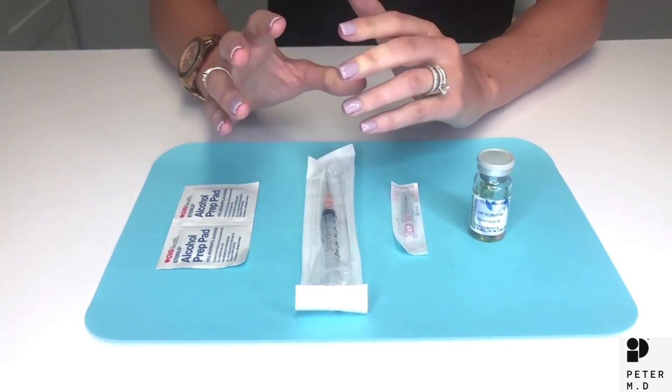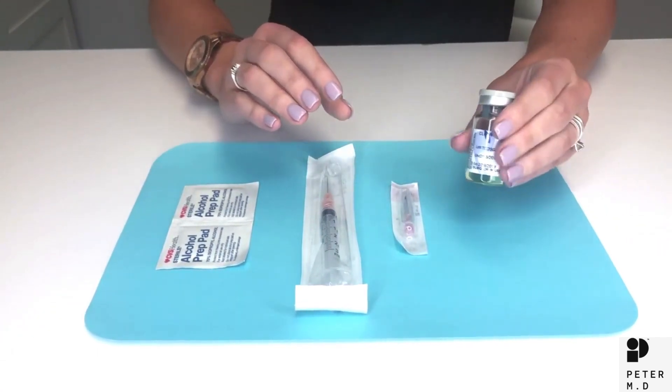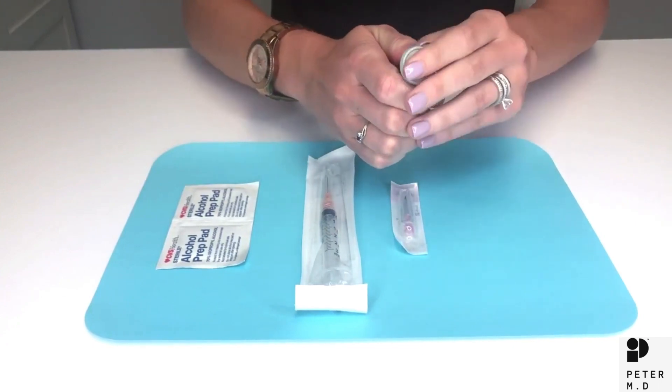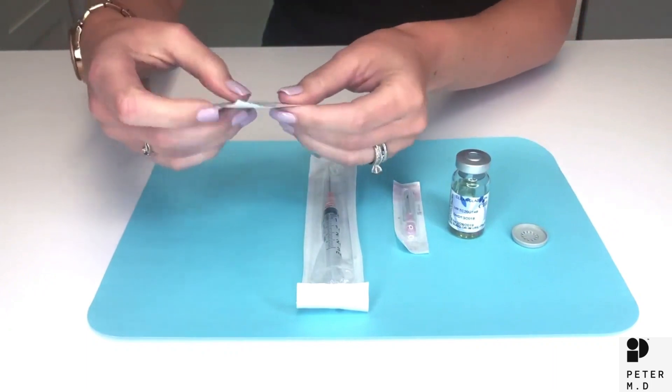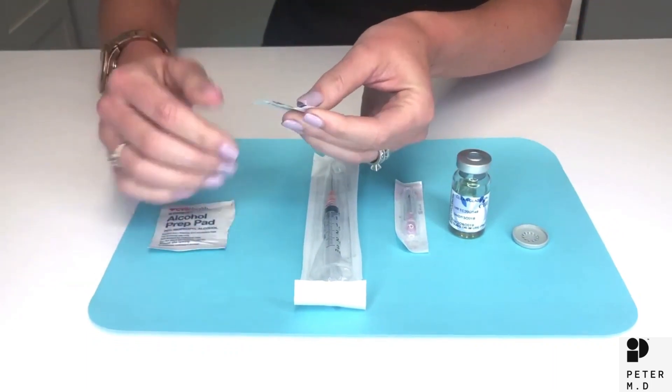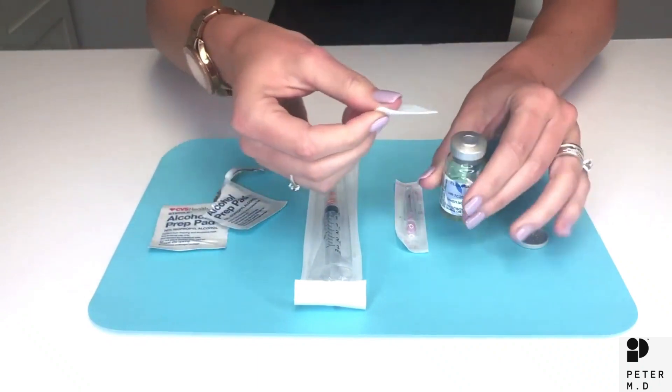First make sure your hands are clean. If this is the first time using the testosterone vial, pop the plastic safety cap off of the top. Next use one of the alcohol swabs to wipe clean the rubber center part on the top of the vial.